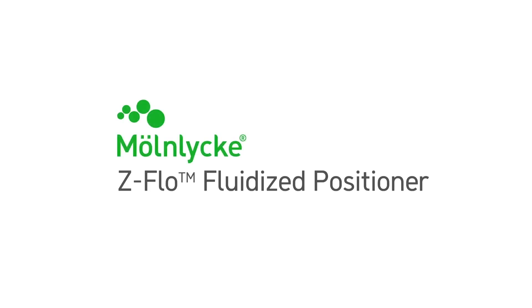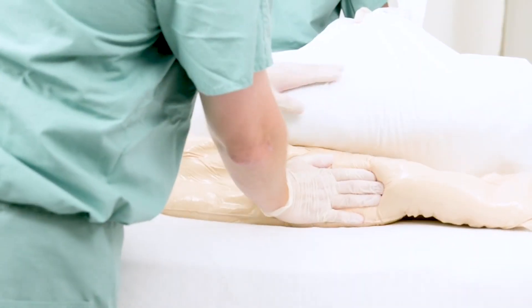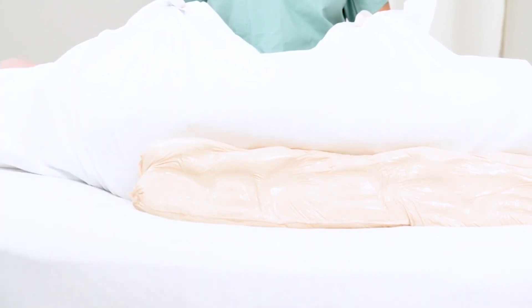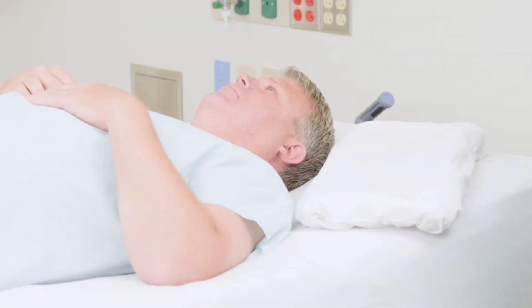Molnica ZFLOW fluidized positioners are specifically designed to help reduce pressure injuries and improve overall patient care. Fluidized positioners are easy to mold and conform to virtually any shape, and they also maintain their shape when molded to a patient. Let's look at applications for the positioner.